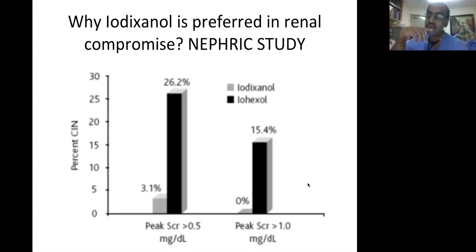Let's assume there is a patient who has a severe coarctation of aorta with left ventricular systolic dysfunction and low renal perfusion. The child will completely shut down the kidney the moment you complete the coarctation angiogram and dilatation because of the contrast.